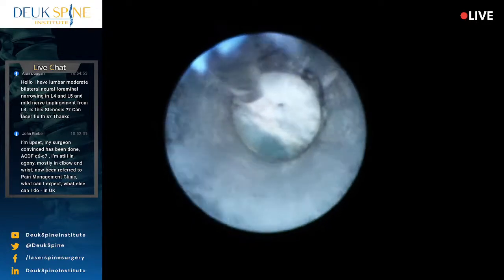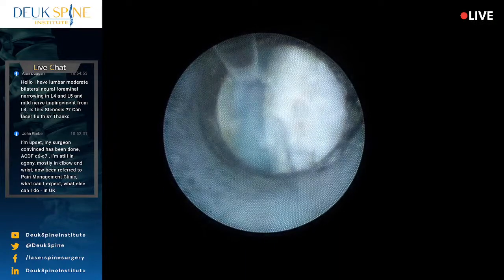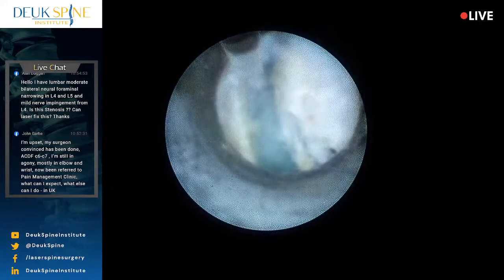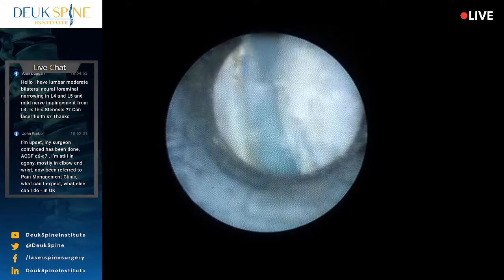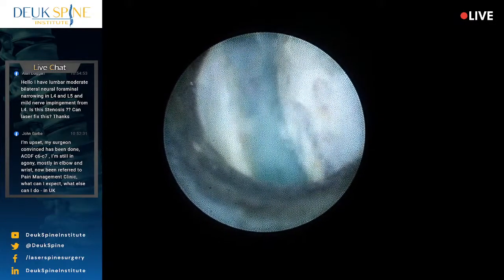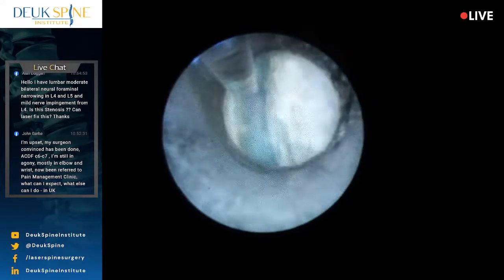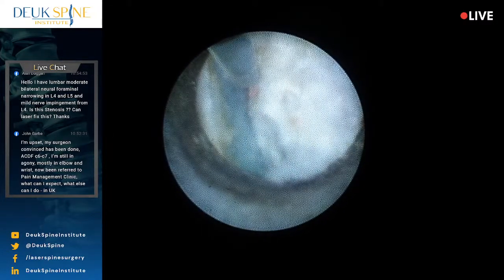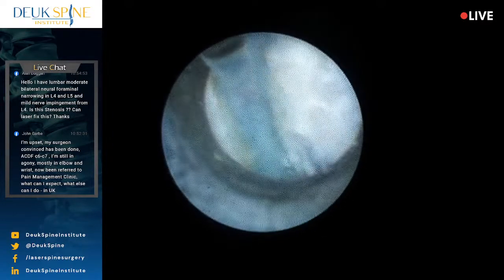So I'm going to keep going out the left foramen. I want to see if there's any more herniation out here. So I'm going to be adjusting the tube a little bit. And if you do this kind of surgery, it's very important you don't torque on the endoscopic tube, okay? That's where the fiber optic things are. And if you're torquing on that endoscopic tube, guess what? You're going to break those fibers. You've got to torque on the actual tube, the stainless steel tube, the tubular retractor. That's where you apply force.